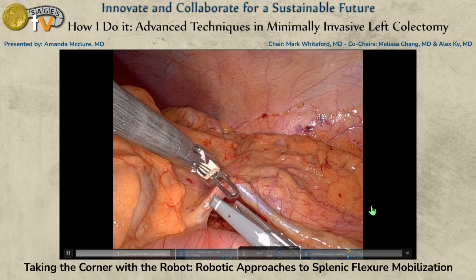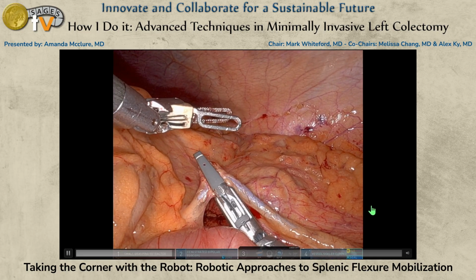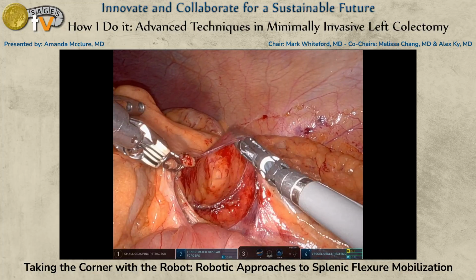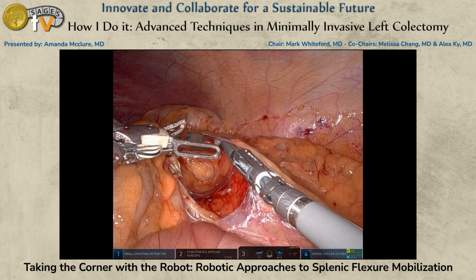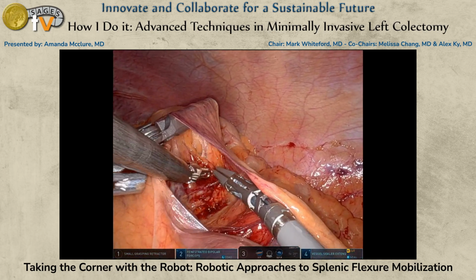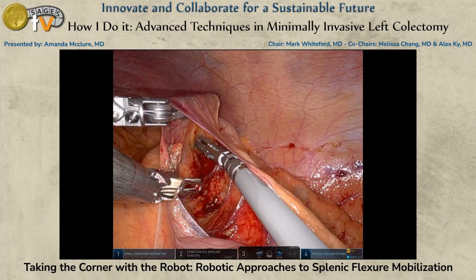Pancreas is, again, down below, but you really can't get a better splenic flexure mobilization than by taking it off the base of the pancreas. So if you've mobilized all of these ways and you have medially and off the base of the pancreas, if you still don't have length, you need to start taking vessels. So this is a really good way to know kind of if you've won.